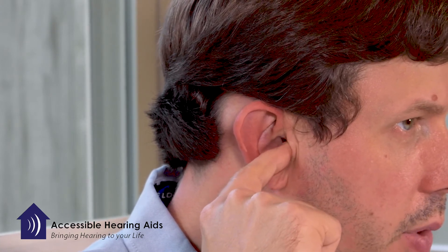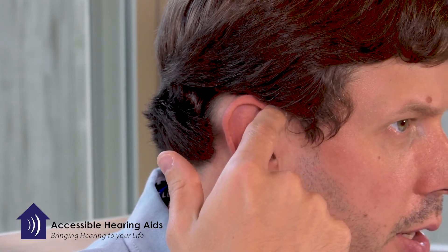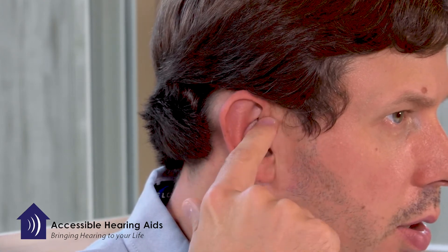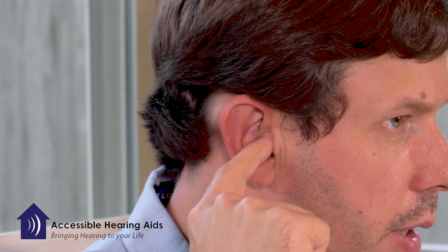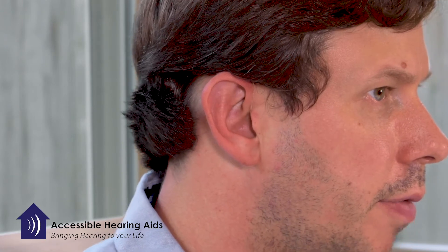You cannot insert this too deeply and you should not be able to create any damage in your ear by just gently pressing on the wire to make sure it's inserted all the way. You want the wire to remain flush next to the side of your ear.